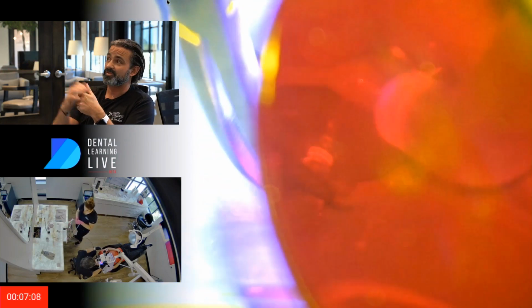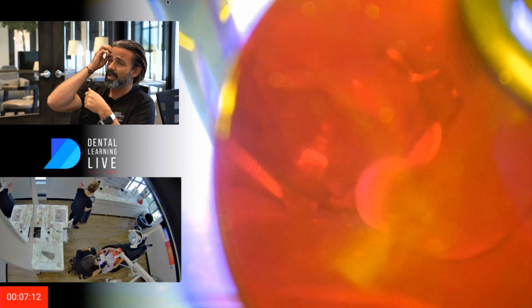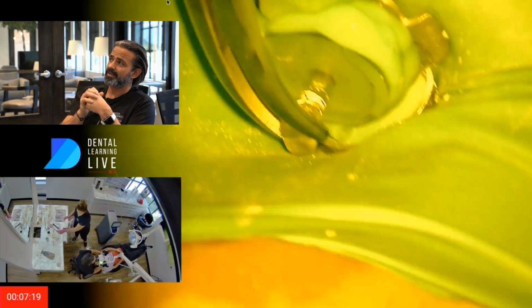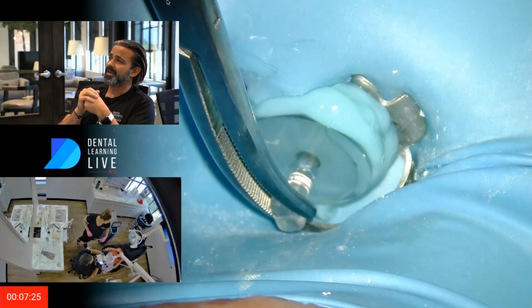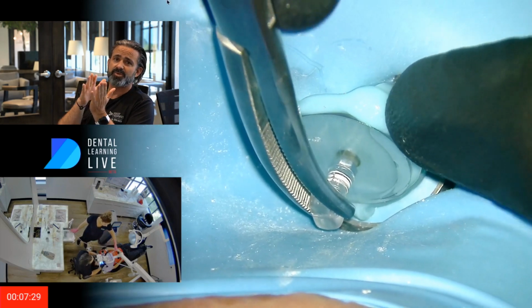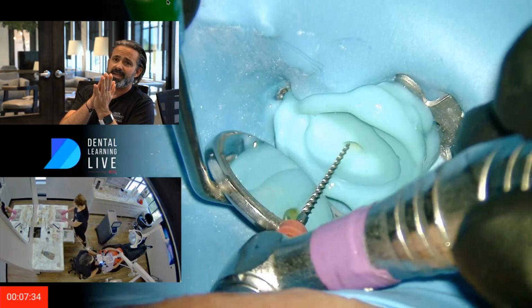So this was definitely a procedure of choice here. I built up all the way around that tooth with excess, curing it, and that little jig that you see me holding with hemostats is just a platform build, just a matrix. It's going to make a depression in that sound seal for the procedural instrument to marry together and create a connection.